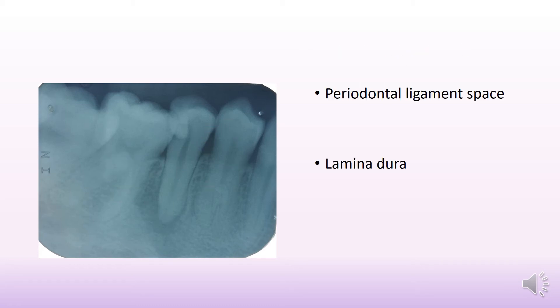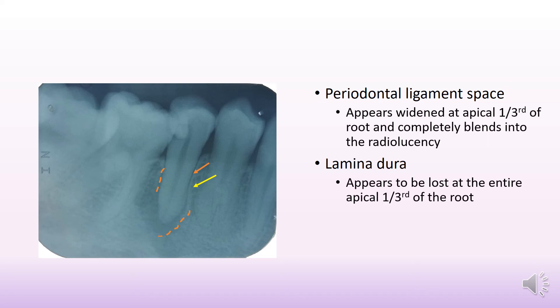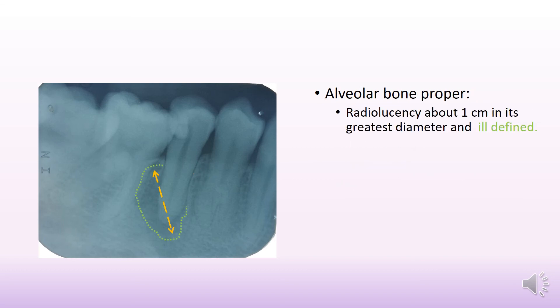Moving on to the periodontal ligament space and lamina dura — it is glaringly visible that there is a periapical radiolucency. The PDL and lamina dura are not continuous. The orange arrow points to the black line indicating the PDL, but you cannot demarcate the PDL at the apical one-third. The yellow line indicates the lamina dura, which is fairly thickened in the middle third of the root, but at the apical one-third there is discontinuity — almost a loss of lamina dura and PDL.